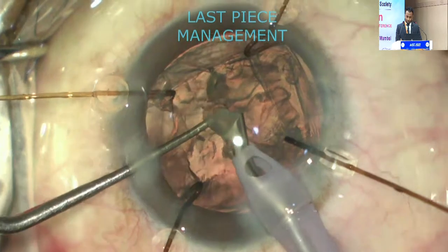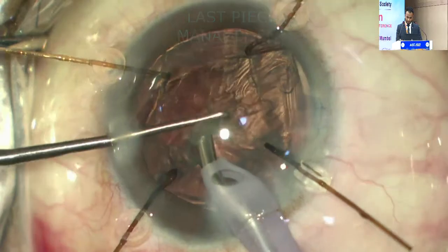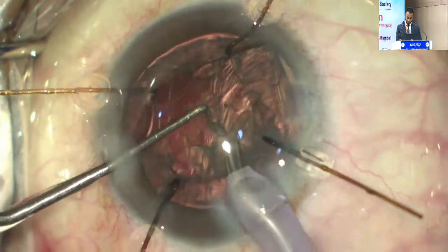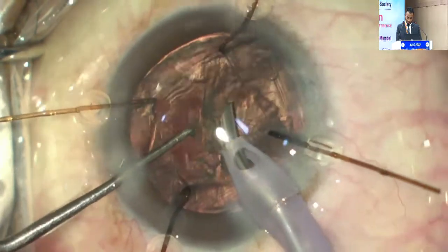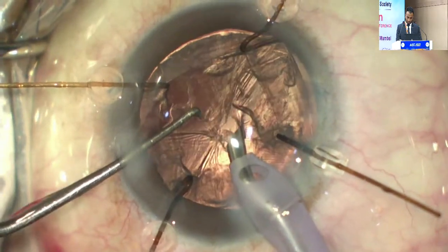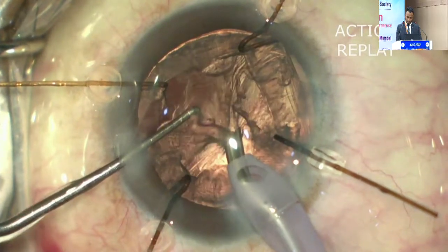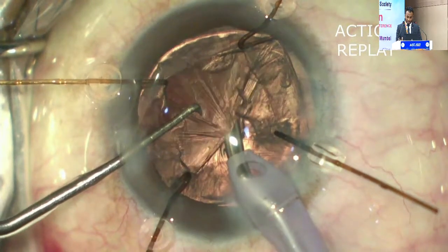Even with lower parameters, now this is the last piece. I just thought I was relaxed and done, and just see what happens now. Okay, the PC just caught. I'll just slow it in slow motion again. Use timely reflux and let it back.